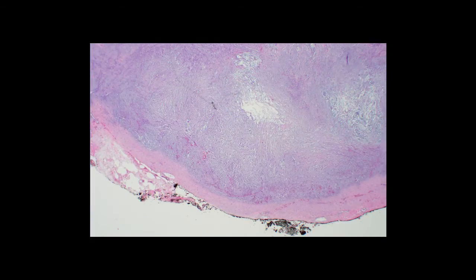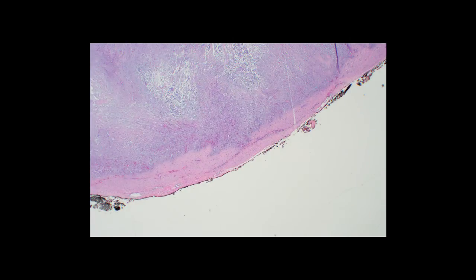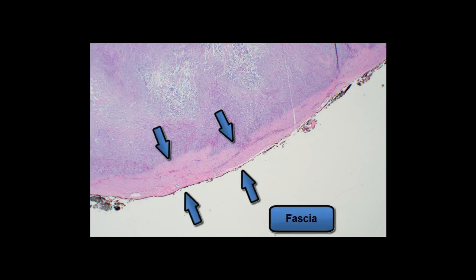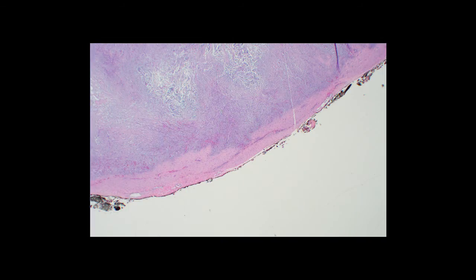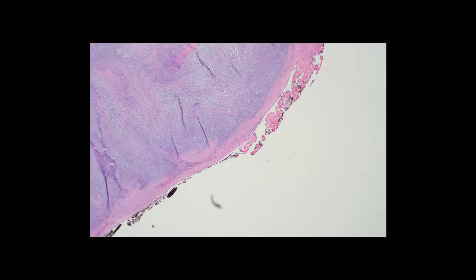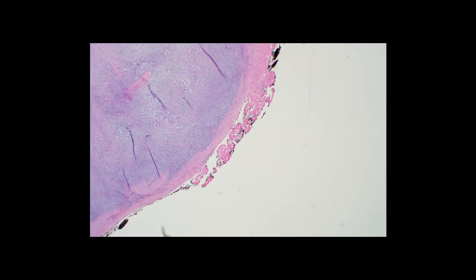Moving around the periphery of the lesion, you can appreciate this thick fibrous layer — this is actually compressed fascia from which the proliferation is arising, thus the name nodular fasciitis. And you can see here some skeletal muscle bundles on the other side of the fascia, so this lesion is probably pushing up from the fascia into the overlying subcutis.